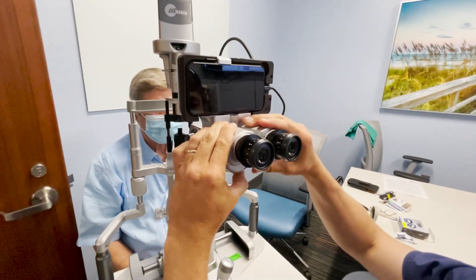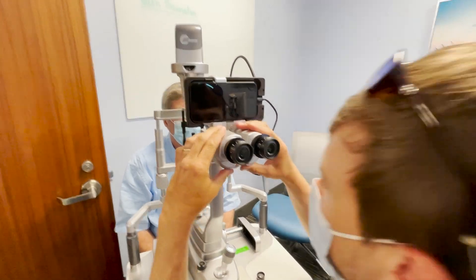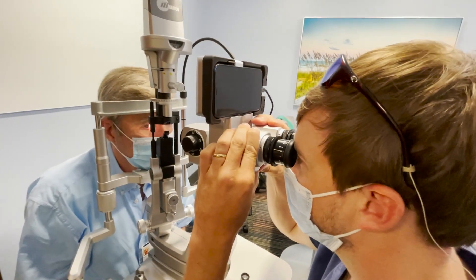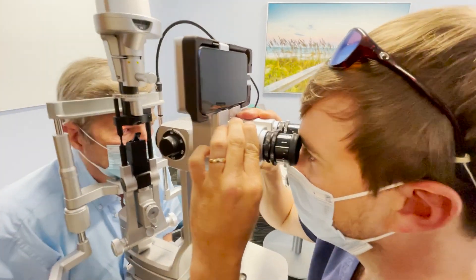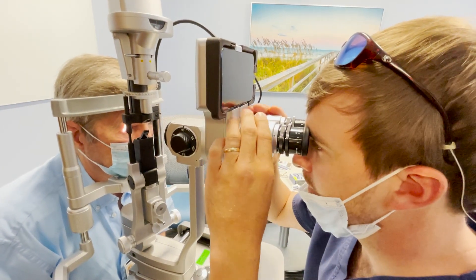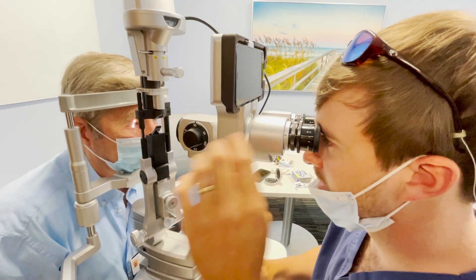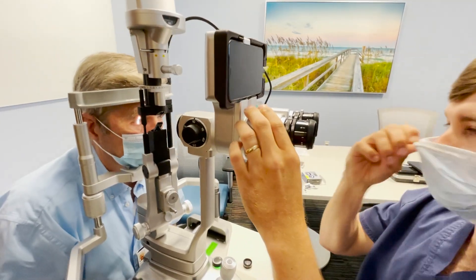You can change your interpupillary distance (IPD) to be perfect for your eyes. If it's too narrow, you can really only see out of one eyepiece. You want to widen it out until you can see much more clearly.